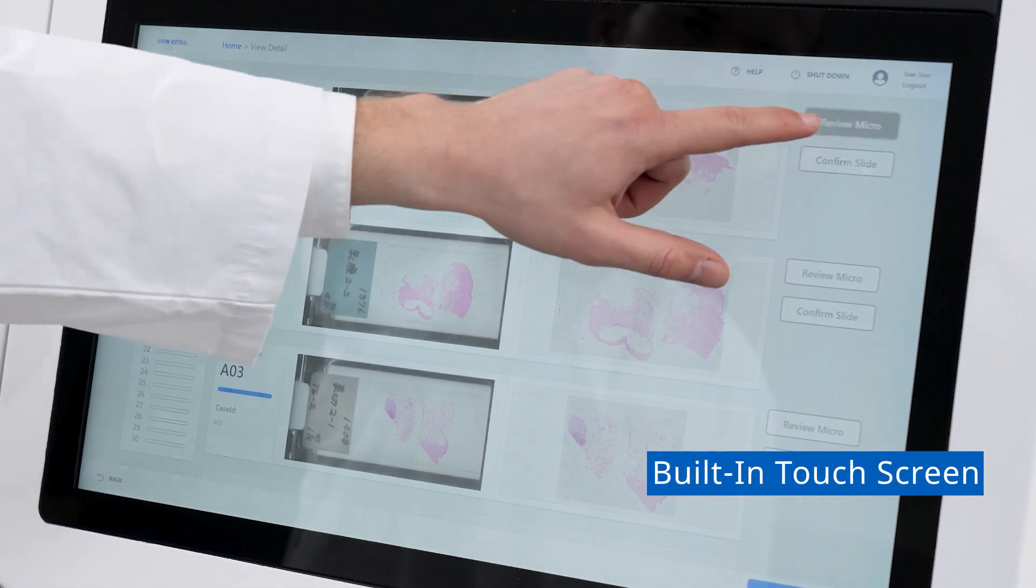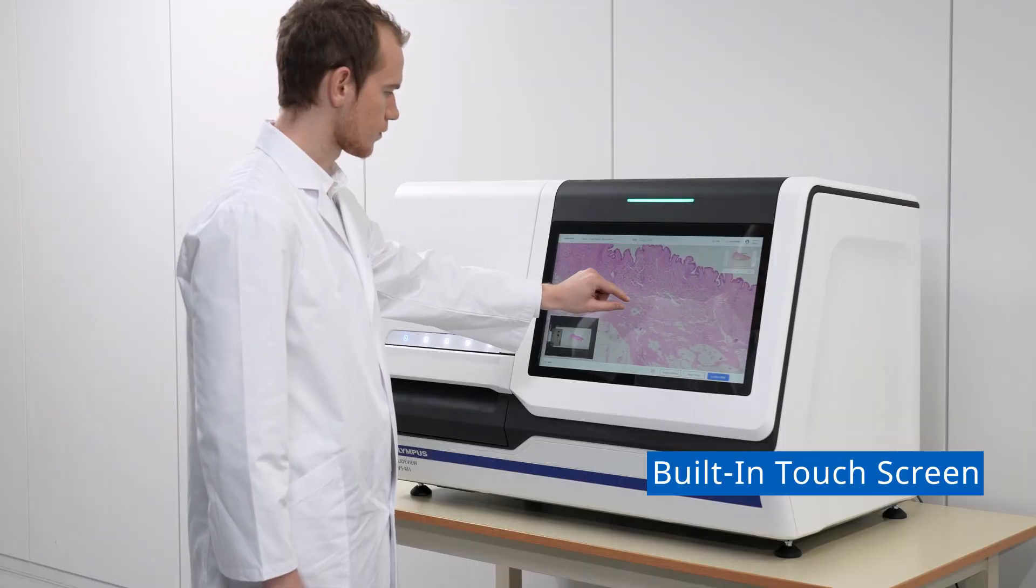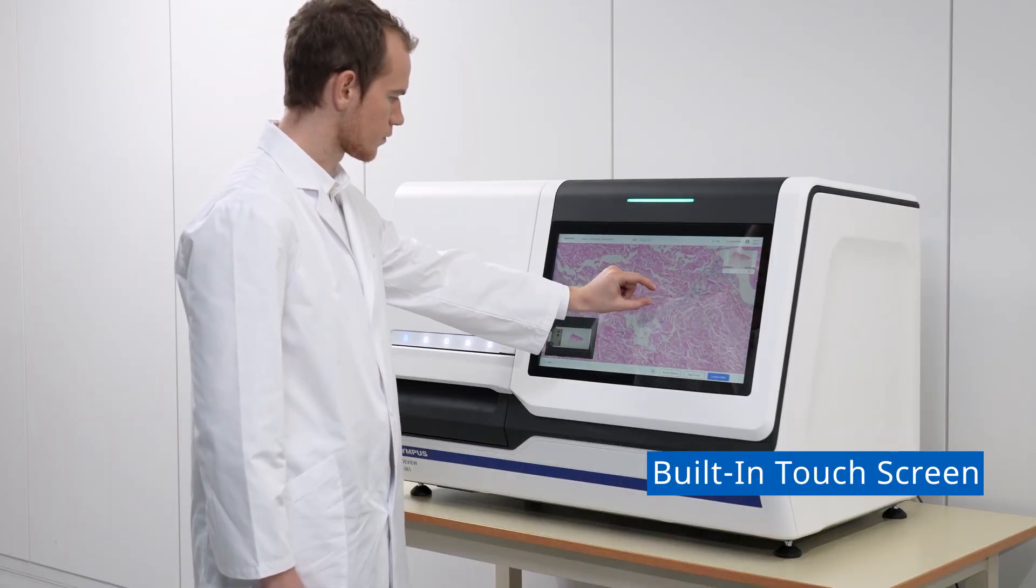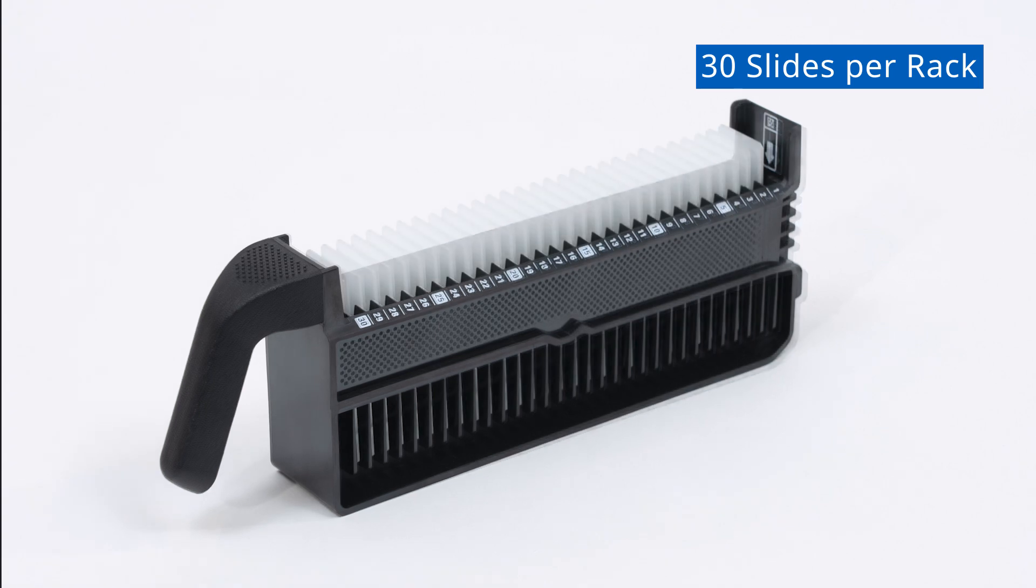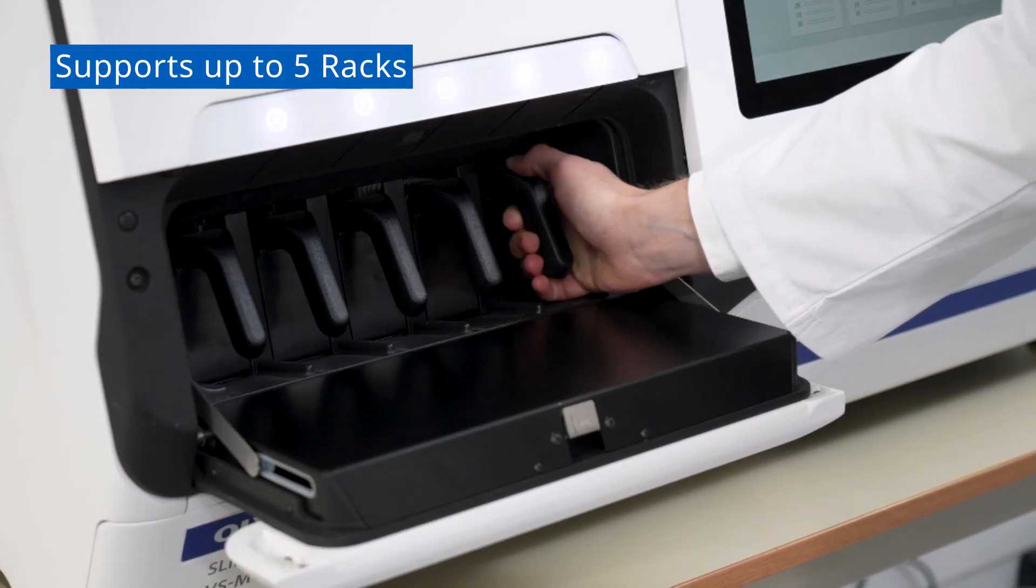Users can operate the VS M1R scanner through the system's large integrated touchscreen. Up to 30 slides can be loaded at once into a rack. The system can hold five racks for a total of 150 slides.